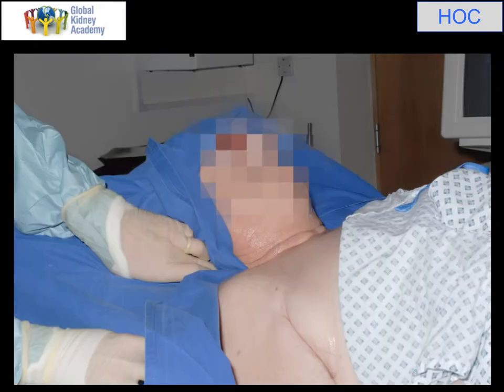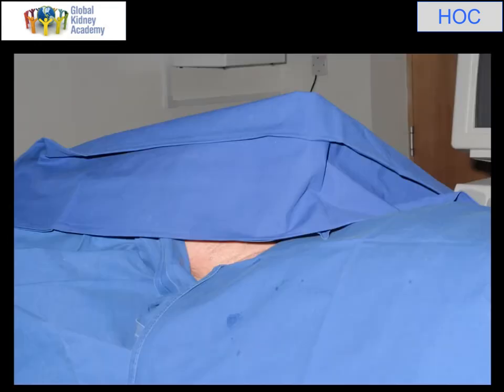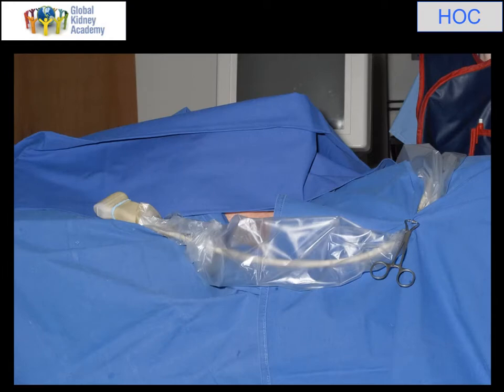This is a simple way of just draping people up. That's the second towel, and that's the third towel — this is a three-towel technique to give me access to the neck area that I require. Next, I've been handed an ultrasound and I've covered it with a sterile cover so that all the ultrasound equipment is sterile, and I've clamped it to the towel.